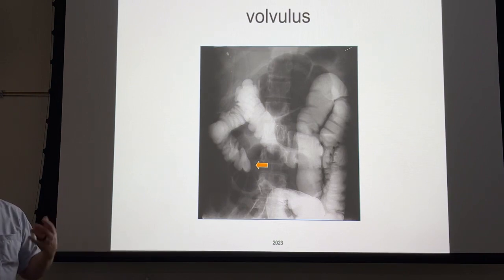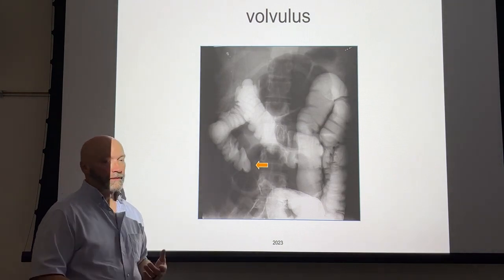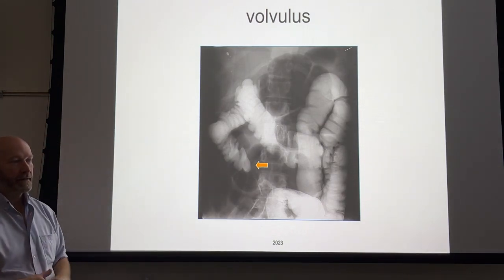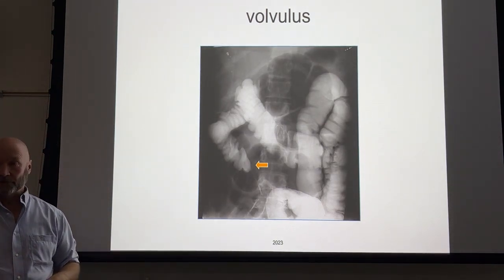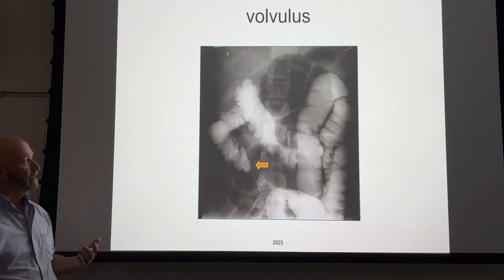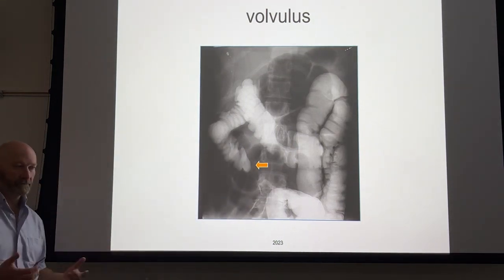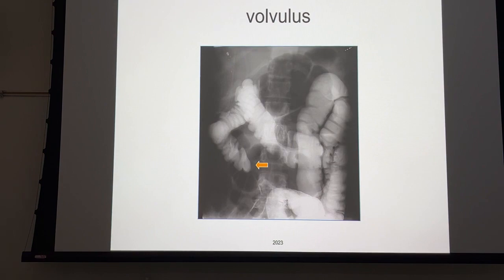It's just smooth, completely lacking those markings. Sometimes it's because of pathologic conditions, and sometimes it's because of overuse of laxatives. So you may see a patient who just doesn't have any haustral markings at all, and that's colitis.